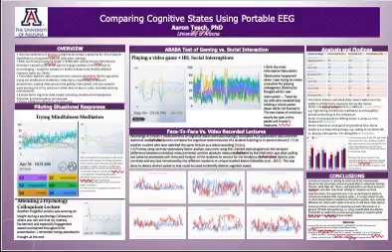So this little mini experiment made me realize that this device could really show different activities that people are doing. And there are distinct patterns that we should be able to pick up using EEG.